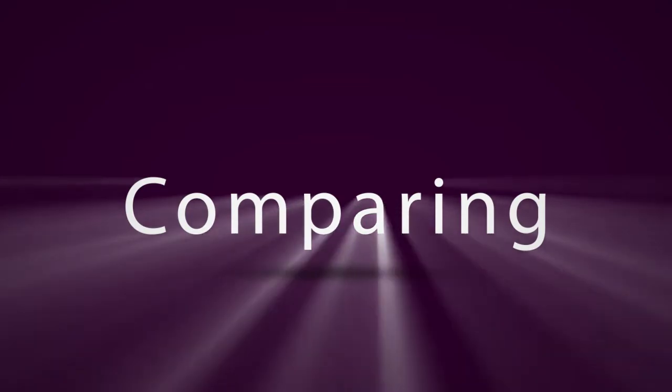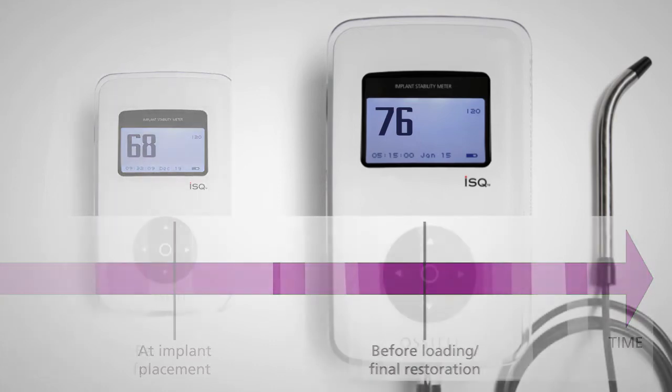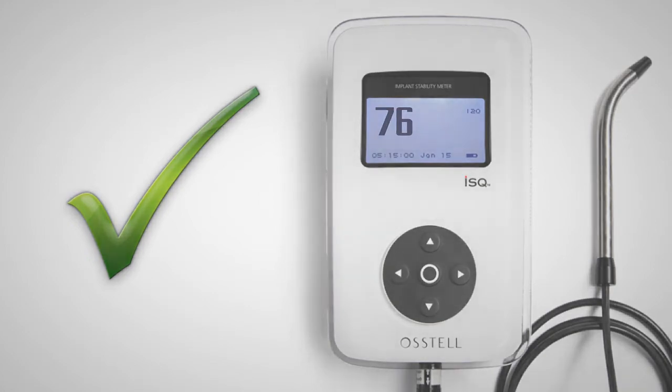Comparing these measurements with the baseline reading of initial mechanical stability at implant placement, the doctor now has a measurement of the exact degree of osseointegration. In this instance, the value has increased since placement, bringing added confidence to the loading process.